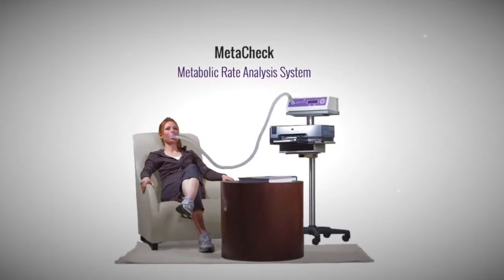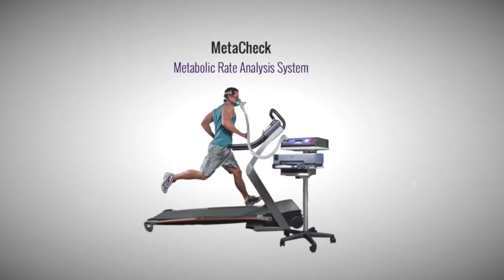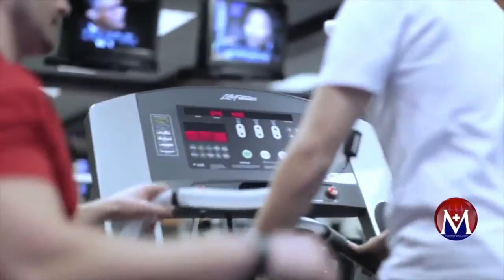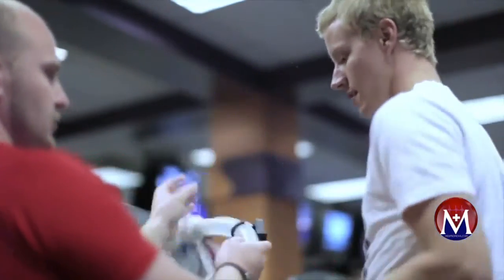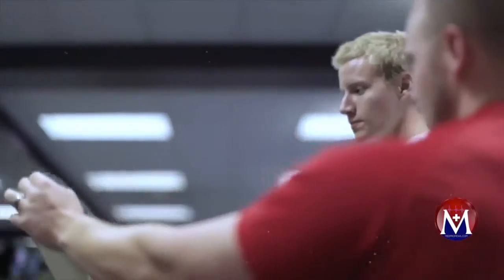VO2 max and anaerobic threshold have long been accepted as the ultimate fitness assessment. But due to cost and complexity, these powerful tools have only been available to high-end professional athletes. The rest of us were left to settle for substandard calculations and estimations. Well, no more. Cardio Coach is accurate, affordable, and provides data for fitness professionals at every level of expertise.